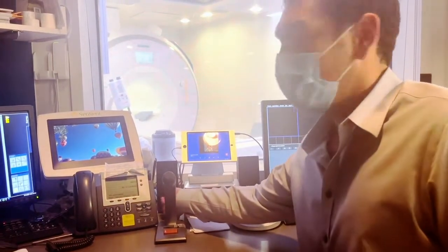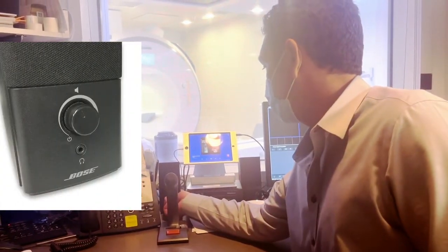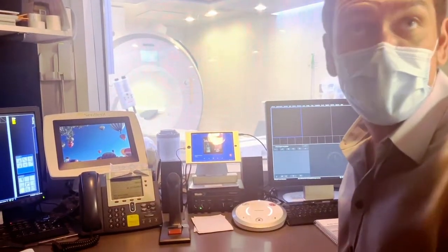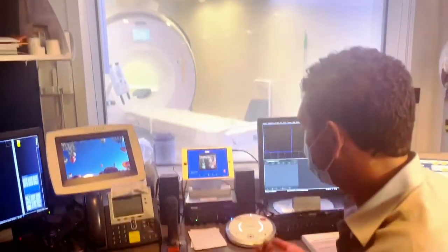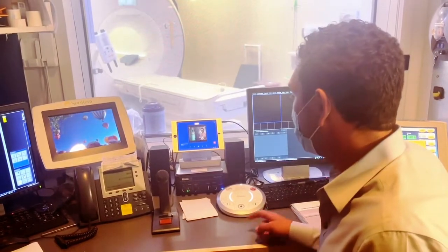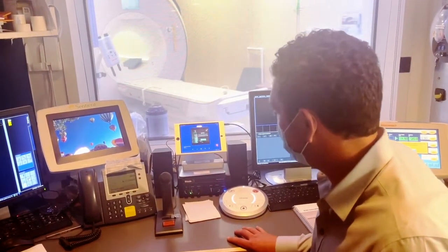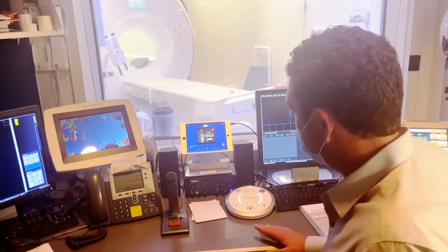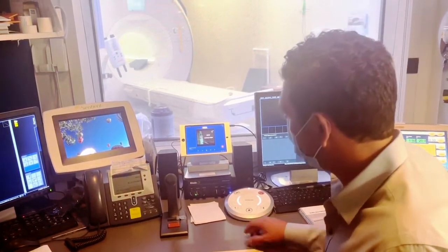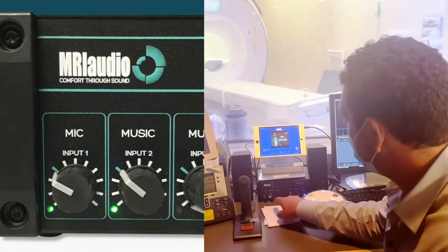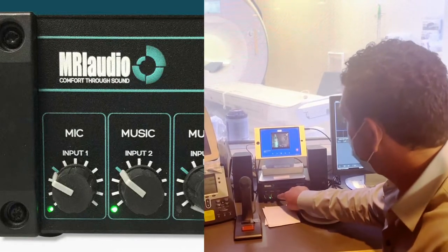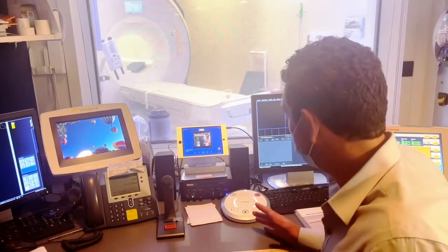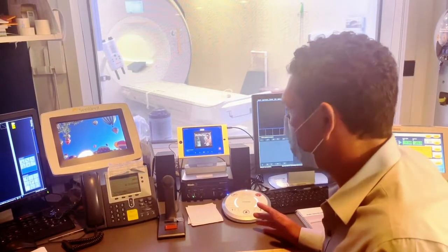To listen to the music, you can adjust the volume on the technologist speaker. This will allow the technologist to enjoy the music or turn down the volume without affecting the patient's listening experience. The digital amplifier controls the patient volume, and you can independently control the microphone volume and music volume. The third music knob is not in use on these systems and would be used for a second music source.